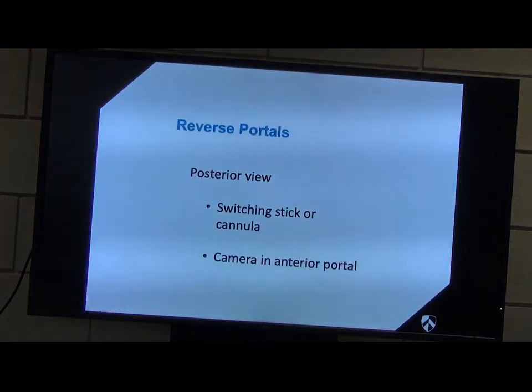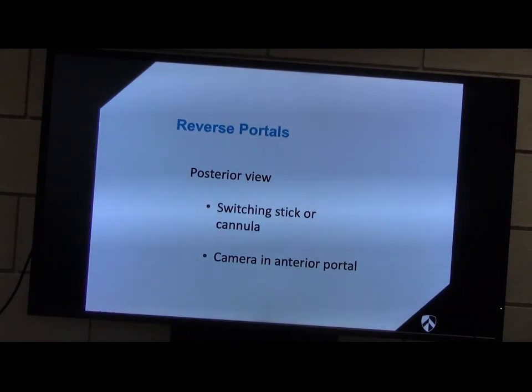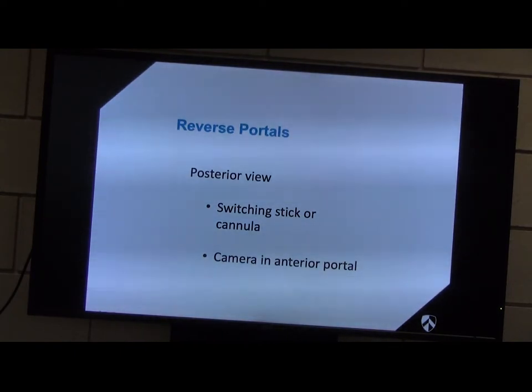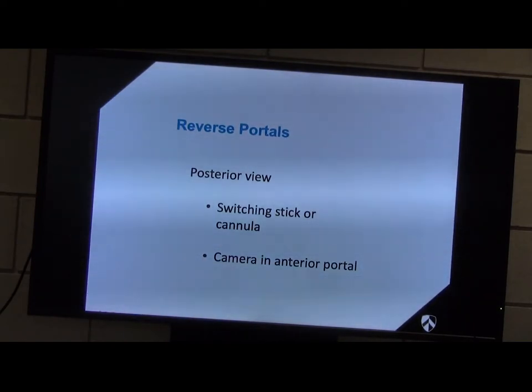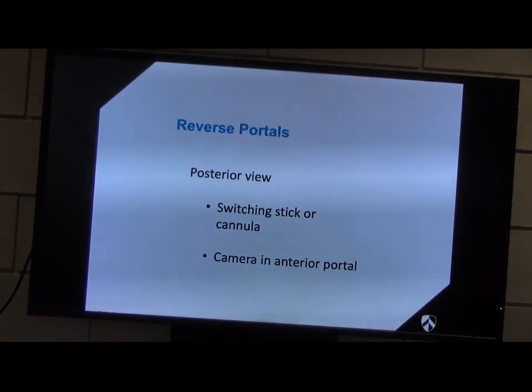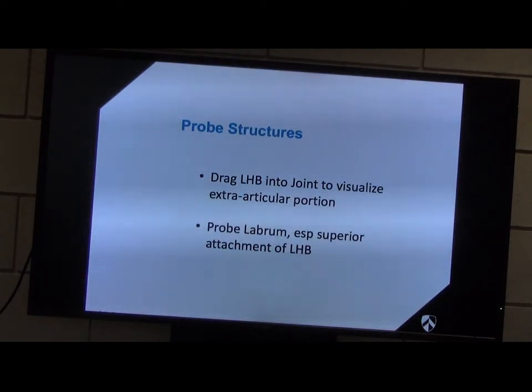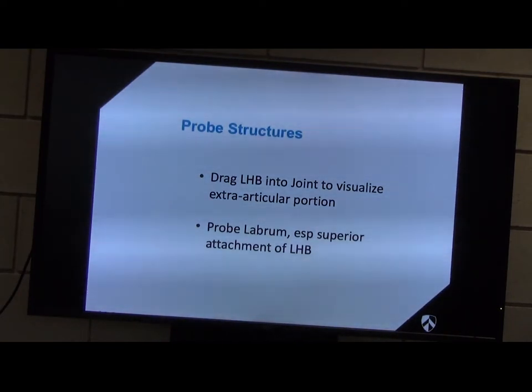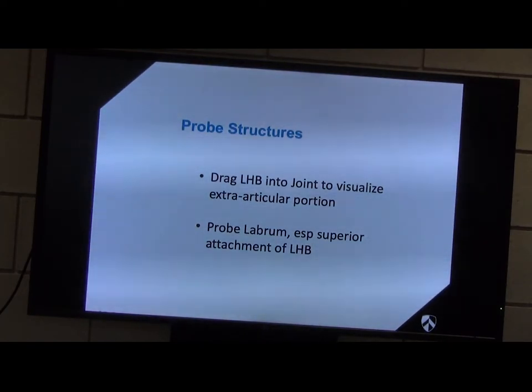You can also, if you've got portals — let's say you've got three portals — you don't always have to look from the back. You can put the camera in at the front or the side. Quite often if you come to theatre with me, I will be moving the camera front and back so you get perspective of what you're actually looking at. If you're looking at something at the back of the subacromial space, it might be easier to have the camera in at the front. Importantly, this is a dynamic test as well — you want to probe all these structures and drag the long-headed biceps into the joint so you can visualise the pathology, which will quite often exist in the extra-articular portion. If there is a split, tear, or fray, it's quite often actually outside the joint.